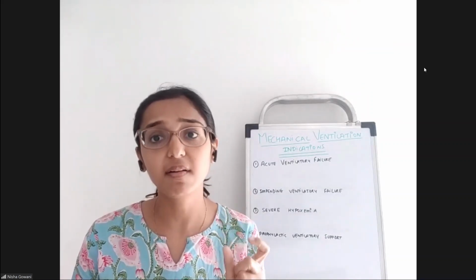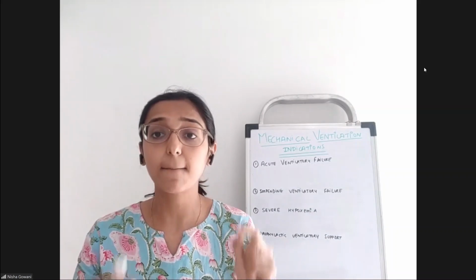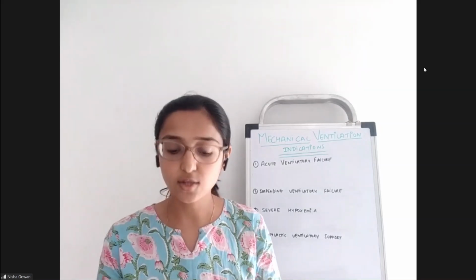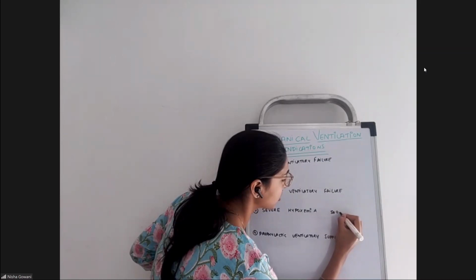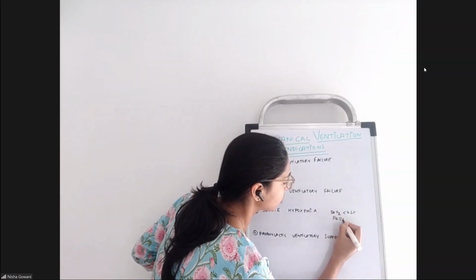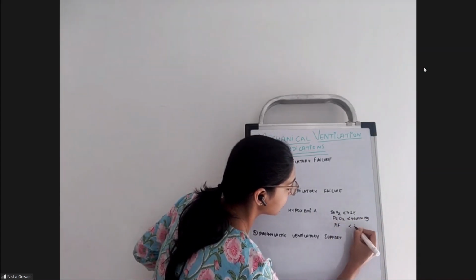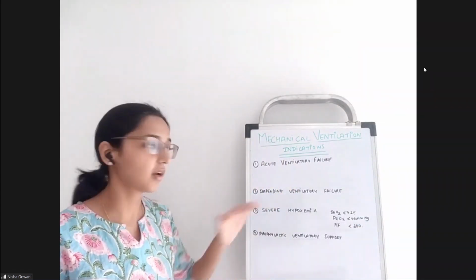Then there is another derived factor that helps you know if the patient is in severe hypoxemia. That is the PaO2 upon FiO2 ratio. So this ratio is nothing that's very difficult. I'll just note it down on the side. So if the saturation of the patient goes less than 75% or the PaO2 is less than 40 mm of mercury or if the PF ratio is less than 300. All right. So that is a situation that the patient has gone into severe hypoxemia.